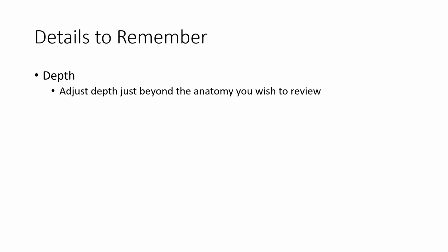And finally, with B-mode imaging, you really want to concentrate on your depth. Lots of times, especially with our sonography students, we see they're scanning beautifully, and yet their image is only taking up maybe a third of their screen, and the rest of it is just wasted space because their depth is too deep. So make sure that you set the depth just below the anatomy that you're interested in or the organ that you're viewing. Anything beyond that is just going to cause the anatomy that you're interested in to get smaller and smaller and smaller, which will of course affect your perception of the anatomy at that point.